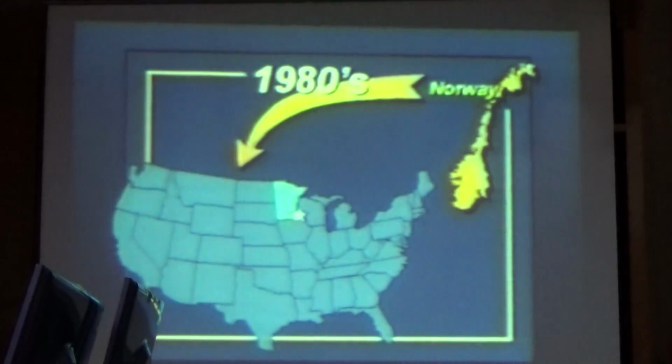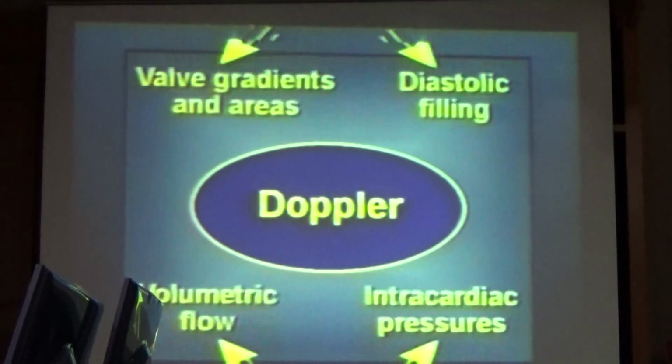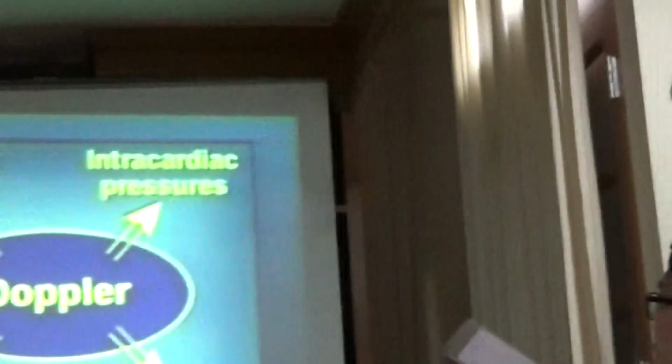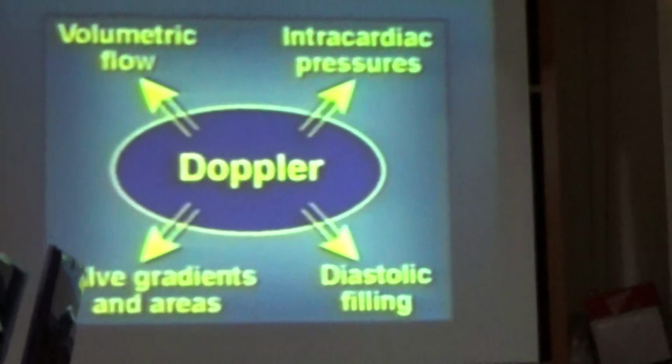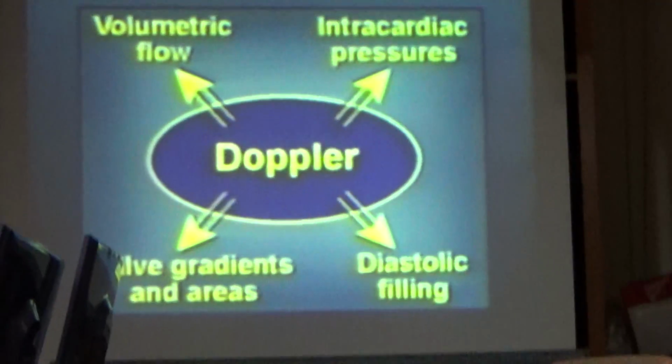The simplified equation, along with the methodology of continuous wave Doppler, was introduced in this country, and various centers, including our own group at Mayo, embarked on many validation studies for confirmation of the simplified Bernoulli equation, derived valve gradients and valve areas, volumetric flow determination, intracardiac pressure determinations, as well as diastolic filling parameters.